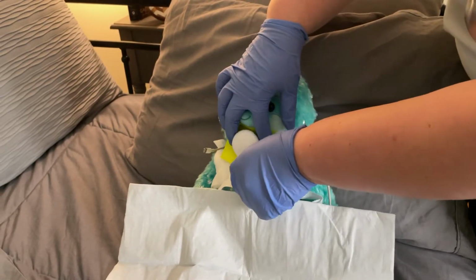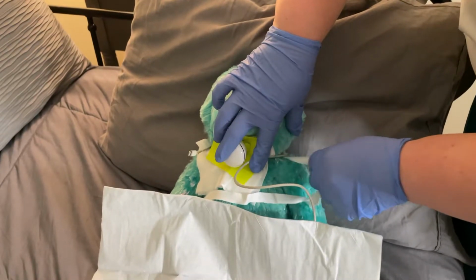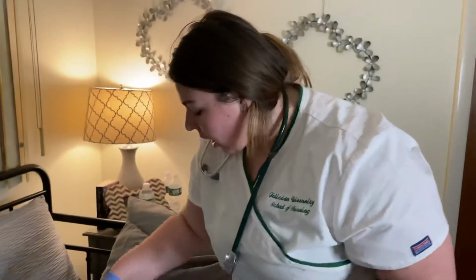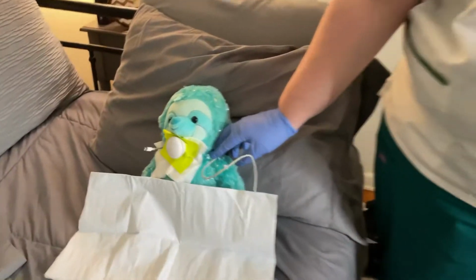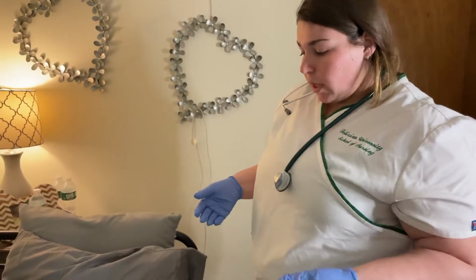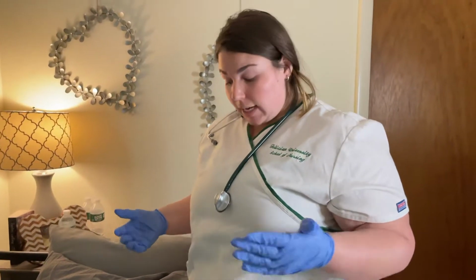making sure to secure the faceplate. And we are going to pull the old one out. You want to make sure when you put the new trach collar on that you put 2 fingers underneath to make sure that there's enough room and it's not too tight on the patient's neck, and you want to make sure that they can perform range of motion actions, that it is not bothersome for them. So after we do that, all of the trach care is taken care of.